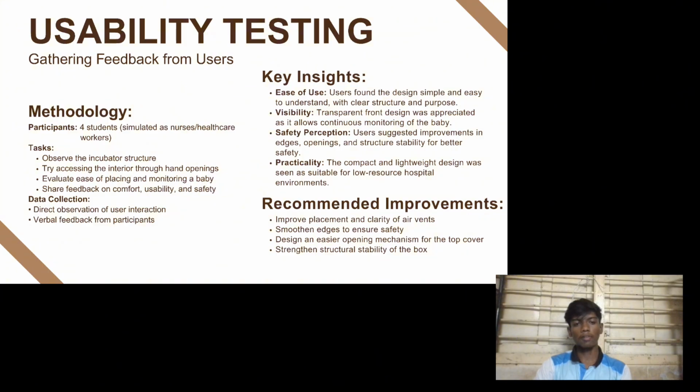safer. And finally, practicality. They said the design is compact and lightweight, so it is suitable for low resource hospitals. Then the recommended improvements, now based on feedback. We suggested some improvements. First, we should improve the placement of air vents so airflow becomes better.